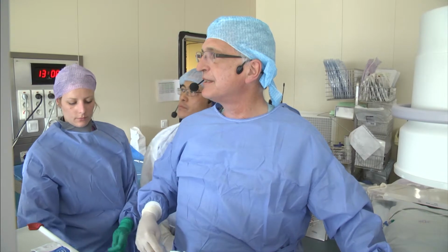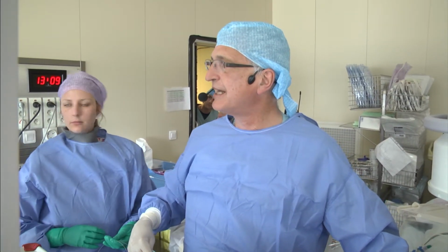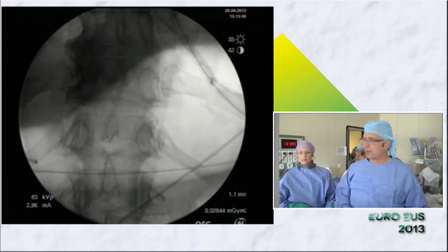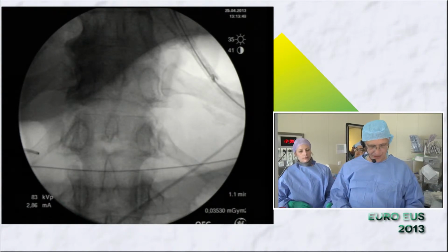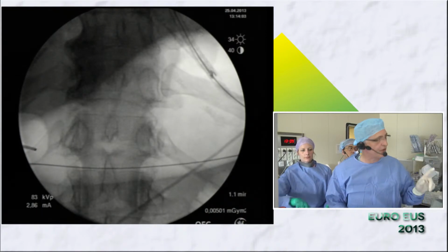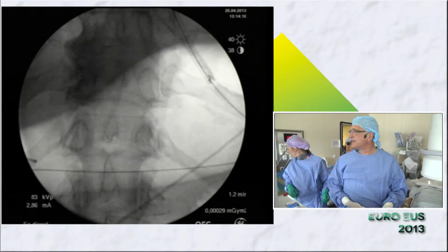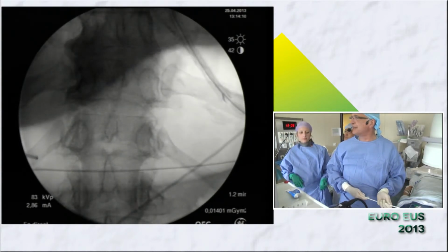Fluoro, please. So you see that I'm pulling the stent there. I have my marker from the previous exam. I will hold the stent with my right hand, and now I need continuous fluoroscopy. I will hold with my fluoro, please. Okay. And then I will start the deployment.